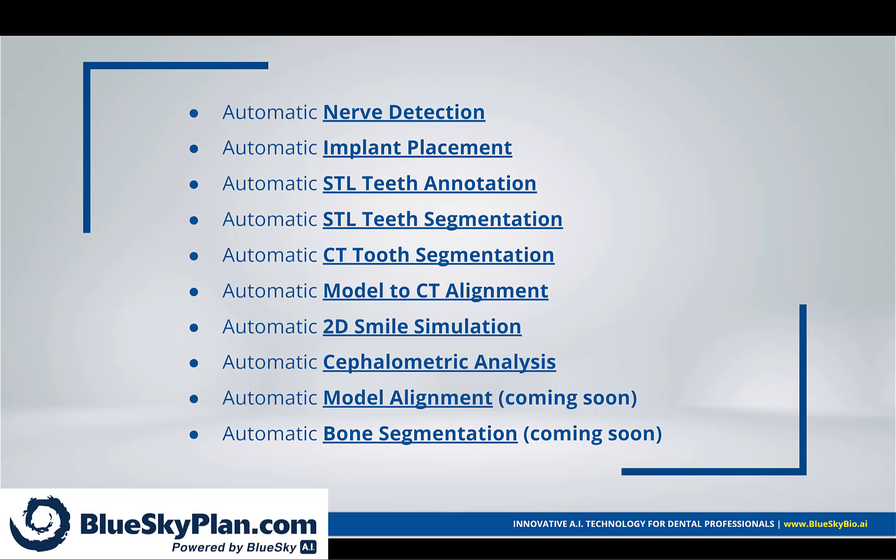automatic cephalometric analysis, automatic model alignment coming soon, and automatic bone segmentation coming soon.